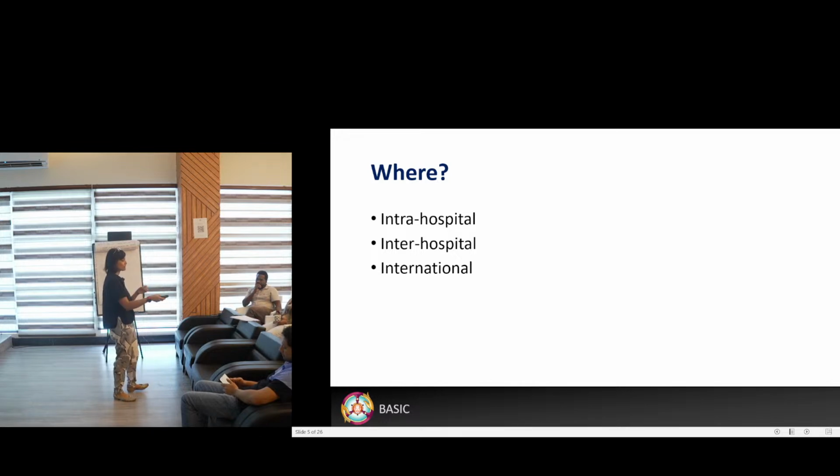Muscle relaxant. I routinely take it. Purely if this patient suddenly starts to, what if she wakes up? It's great for her. Good news, she's waking up. I'm happy her brain is not so bad, but suddenly you can't get a good picture, or along the way she's pulling her tube out. So I'll take muscle relaxant. You can decide to give it before you go, or you can just take it and give it if you need it. Yeah? Okay.